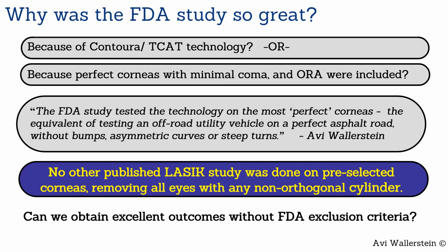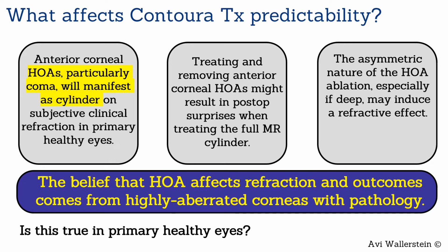Can we obtain similar outcomes without FDA exclusion criteria? Before answering, let's look at what is thought to influence topo-guided outcomes. One theory is that pre-op corneal coma is thought to affect the subjective refractive cylinder, and therefore treating the full manifest may induce new cylinder.